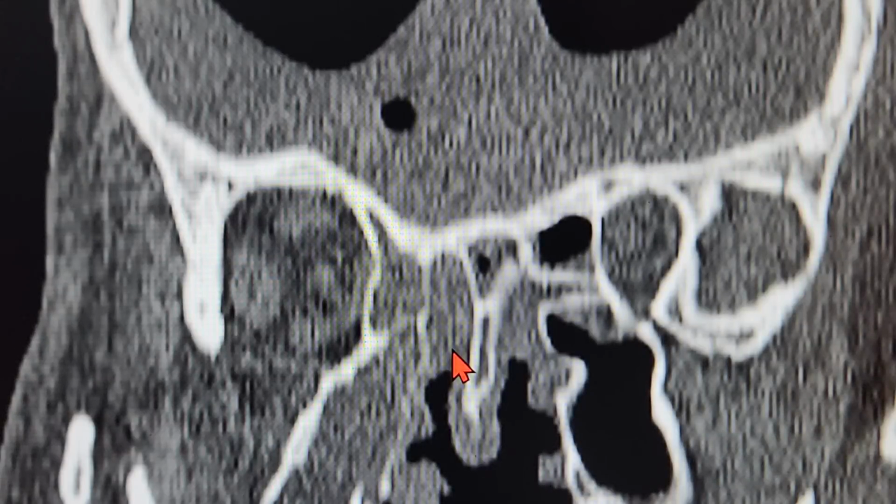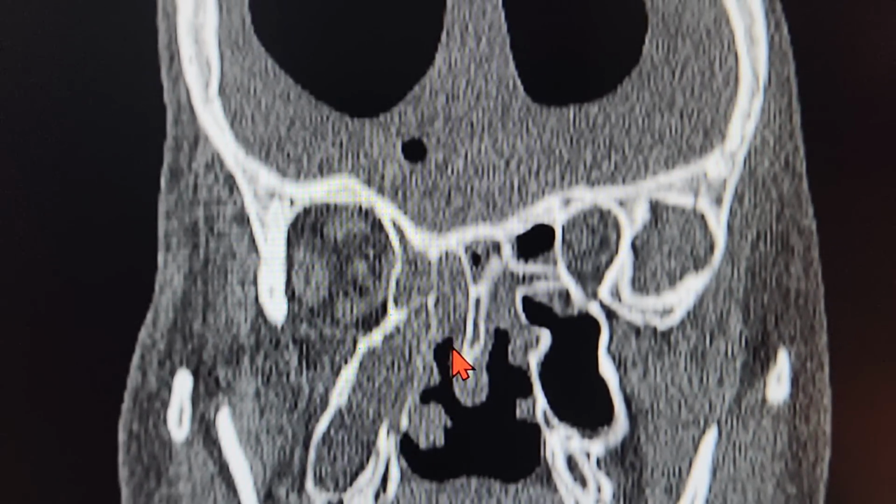So basically what I'm going to do is flush the entire skull base on the right first, probably later on the left. On the right side, I'll be doing a full house FESS. I'll open the sphenoid, anterior and posterior ethmoids completely, open the maxilla completely, A to Z, everything to the full maximum limit, not going to leave a single cell behind. So I'll be performing an actual full house FESS, and then I'll be studying the landmarks.